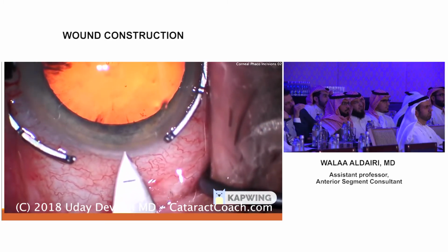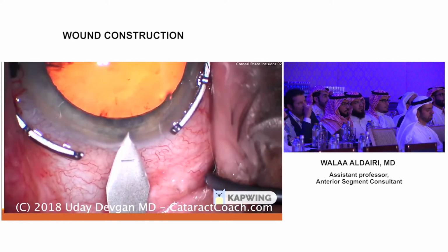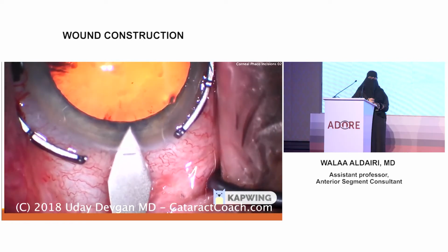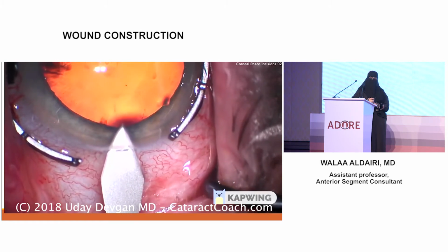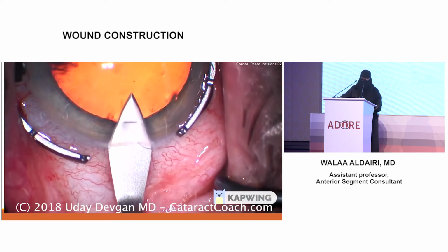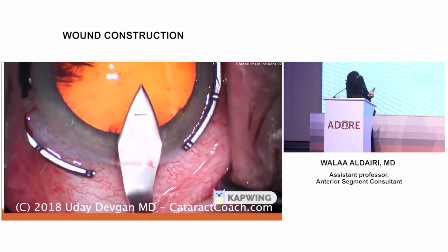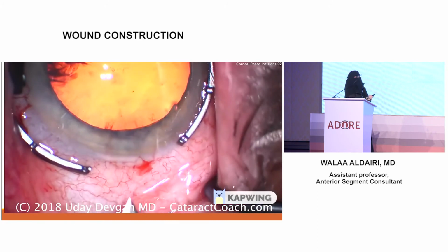Here I want you to look carefully where the keratome passes to the cornea. So it is just in the limbus, nicking the blood vessels, and you can see the mark here in the keratome. You can see this mark at the keratome. Can you repeat it, please?